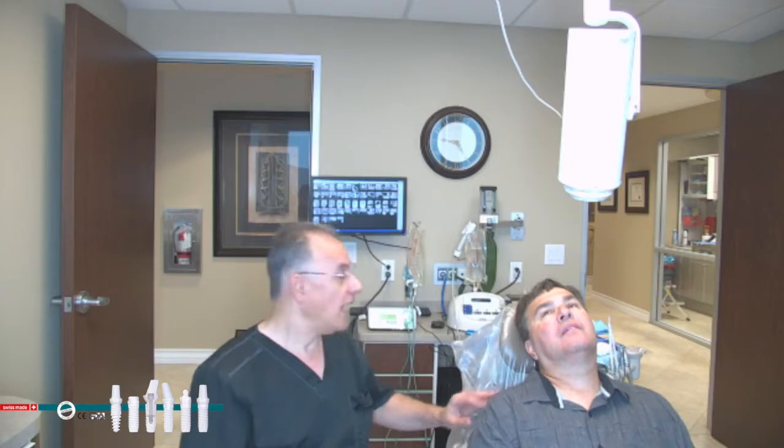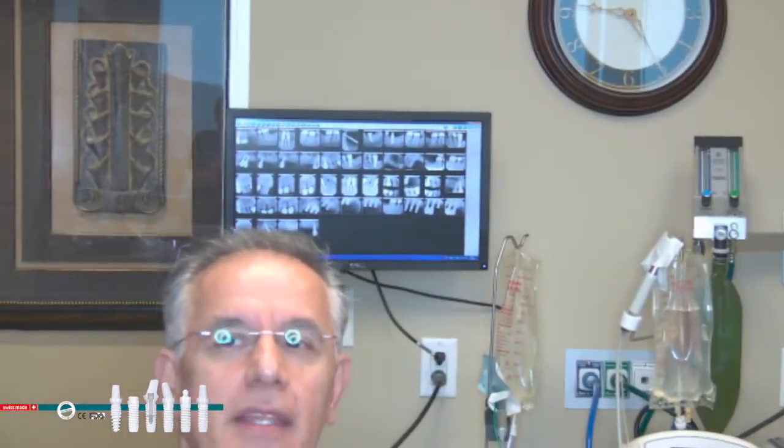Today we're going to have Mark receive a zirconia Z Systems one-piece implant placed on the upper right side of his mouth. He had a sinus graft done on this side about 8-9 months ago, and the sinus graft area has healed. He's missing teeth number 2, 3, and 4. We're going to replace just tooth number 4 today, and in the future he's going to have tooth number 3 replaced as well. Thank you, Mark, for coming today.